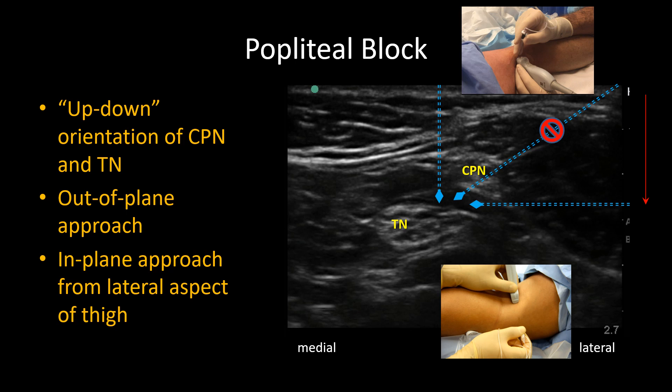The final point to note is that I prefer a view like this one, where the two nerves are not too close together, which creates a larger safe zone for entry.